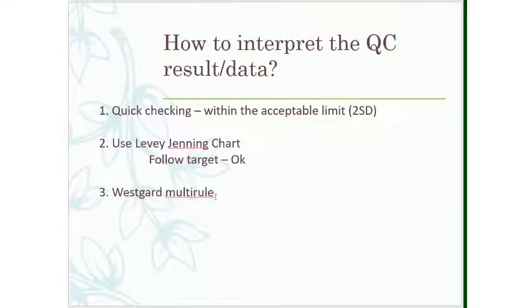And after we get the QC result, how do we interpret the QC data? We use these methods. First, quick checking.